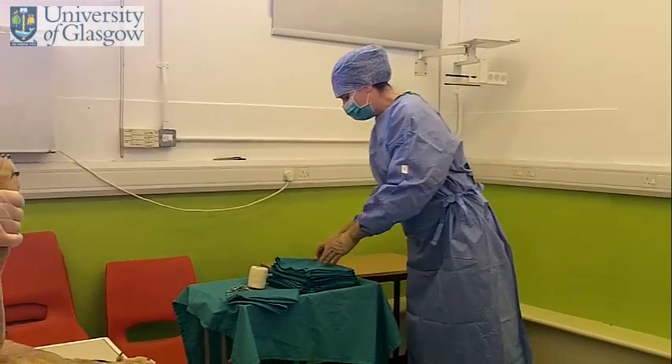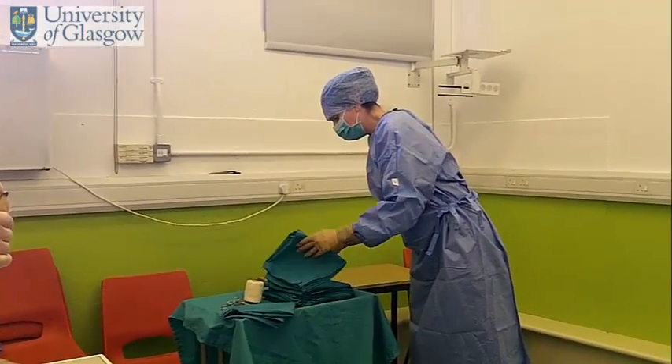Now I'm going to go straight and run draping. First thing you're going to do, pick up a surgical drape.